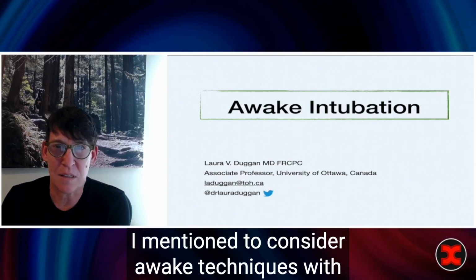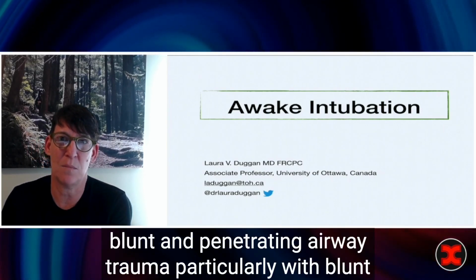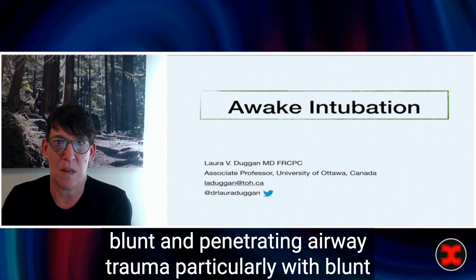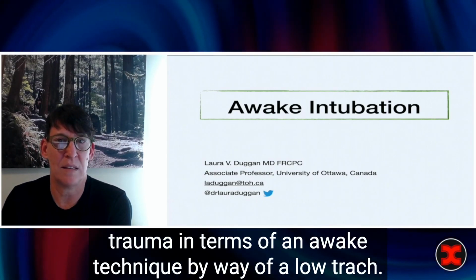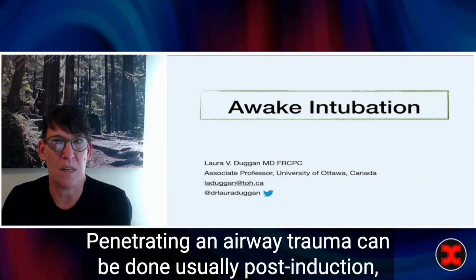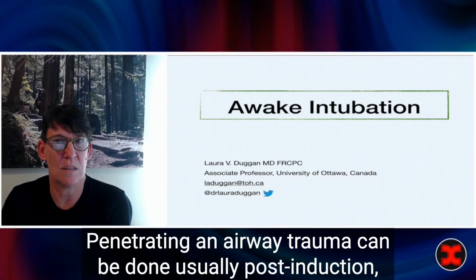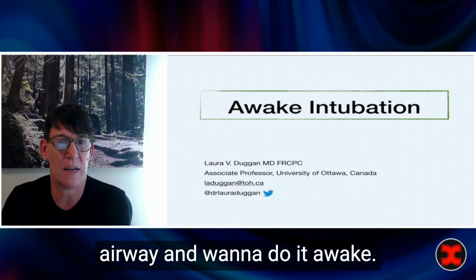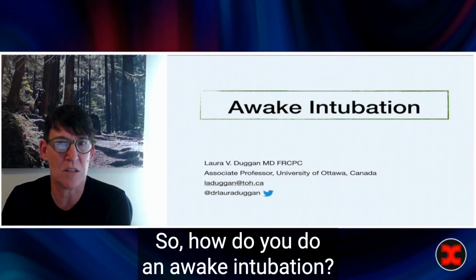I mentioned to consider awake techniques with blunt and penetrating airway trauma, particularly with blunt trauma in terms of an awake technique by way of a low trach. Penetrating airway trauma can usually be done post-induction, but there are going to be times where you're worried about that airway and want to do it awake. So how do you do an awake intubation?